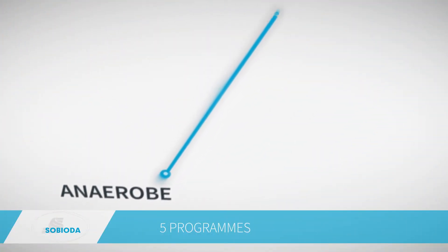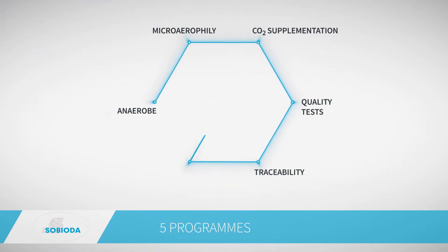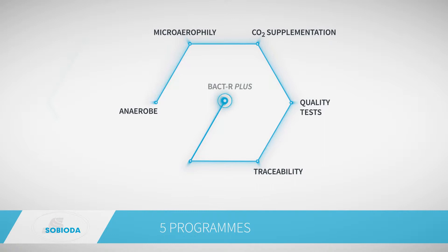BACDAR Plus has different programs: anaerobe, microaerophilic, CO2 supplementation, quality tests, and traceability.